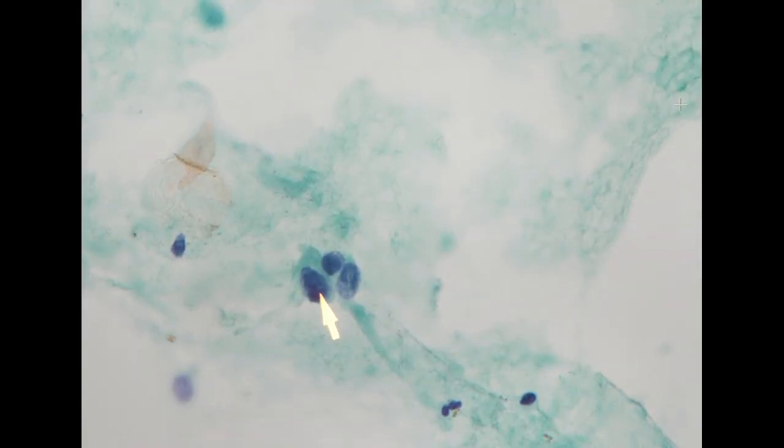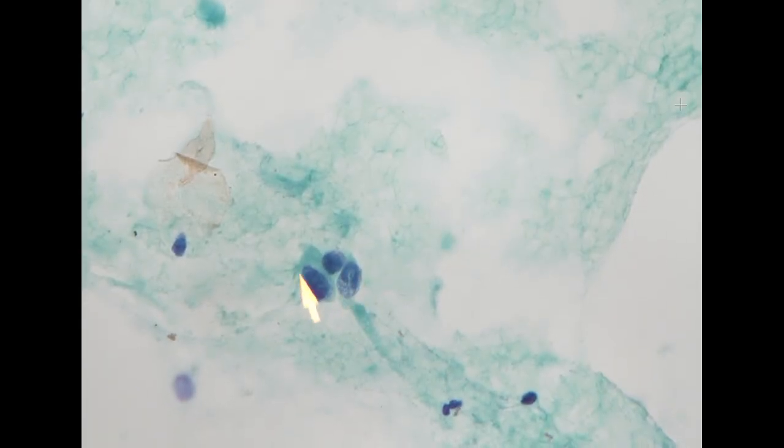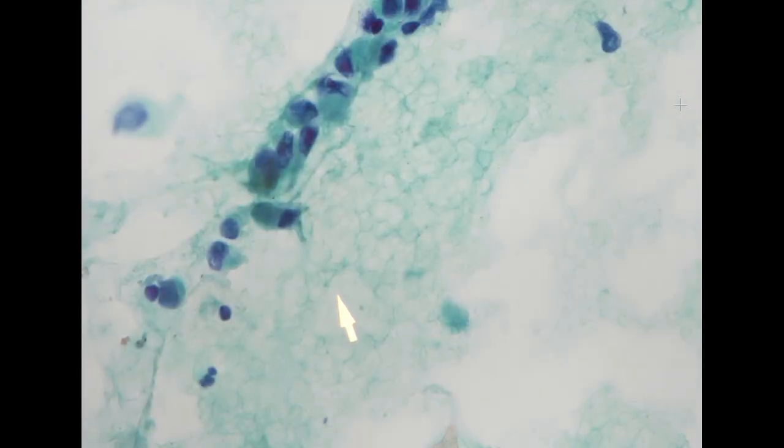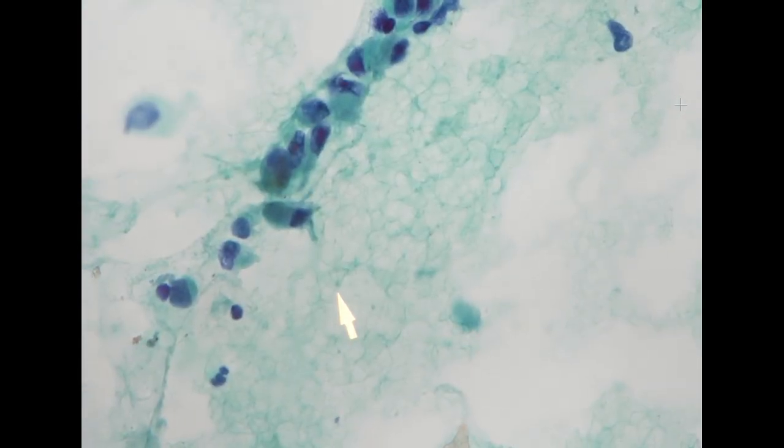The chromatin pattern shows a coarsely hyperchromatic pattern with irregular nuclear contour and small but tight clusters. So this is compatible with metastatic carcinoma.